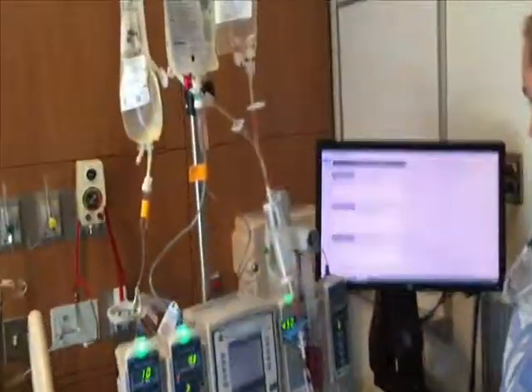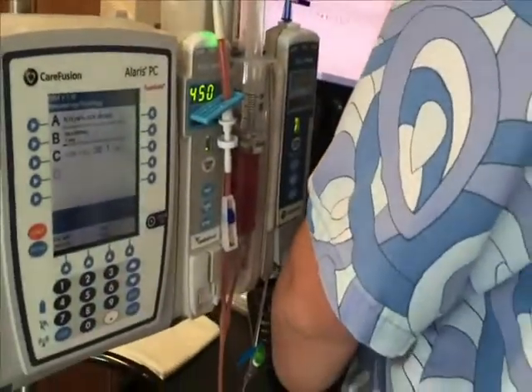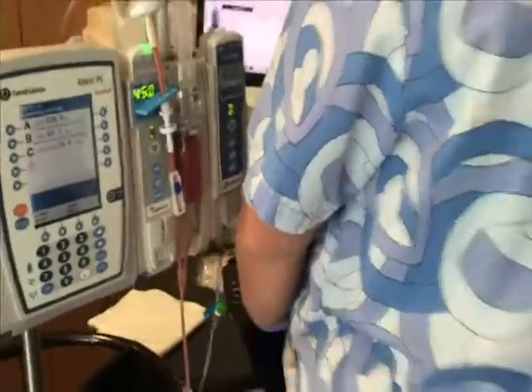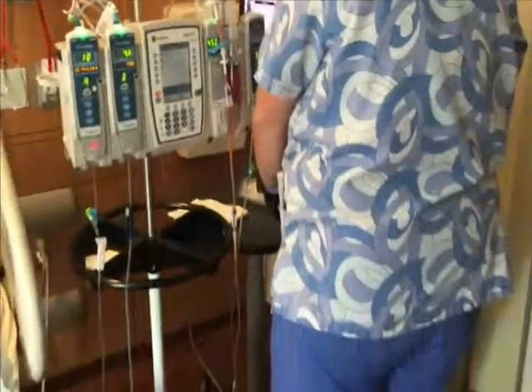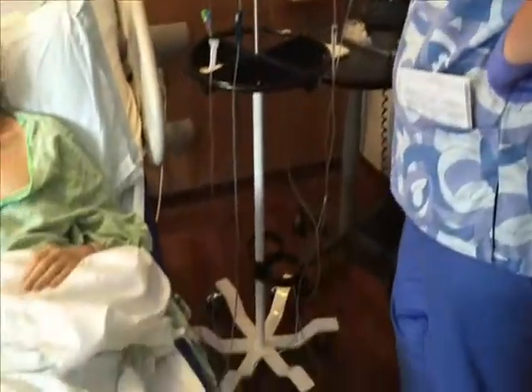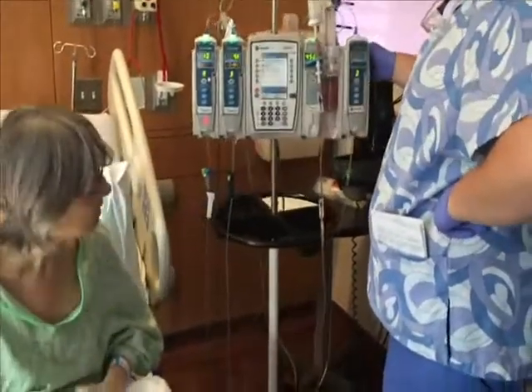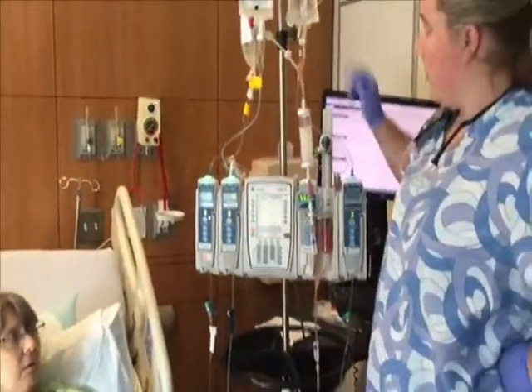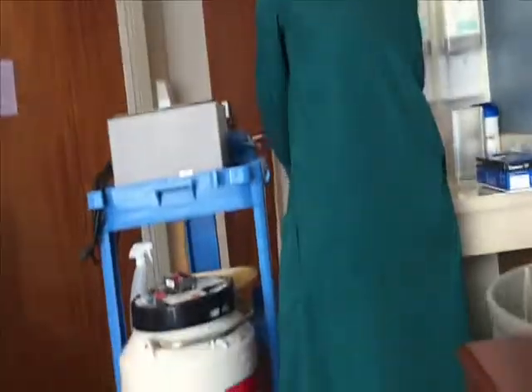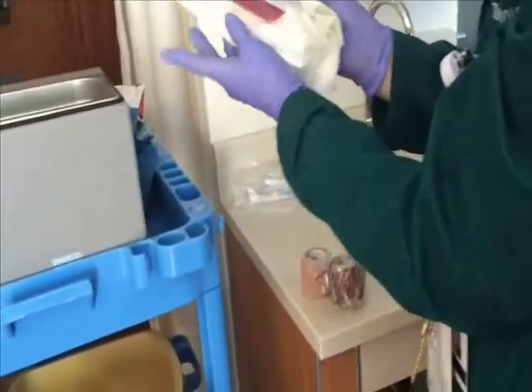So that one's empty. And now the bag is empty, but the syringe, the gigantic syringe, is not. Yeah, and then that machine pushes it down real slow. Oh, I see. Yeah, that's how I pull it up out of the bag. Oh, so it's not really empty. So that's bag 2 and it's ready to go. Okay. Neat.